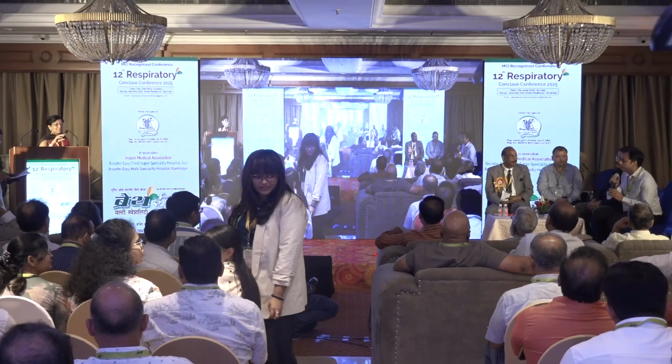Ma'am, being a radiologist, for excessive hemoptysis we can go directly for bronchial angiogram, CT bronchial angiography. Pulmonary angiography is a stage in which we only image the main pulmonary trunk and the right and left pulmonary arteries.